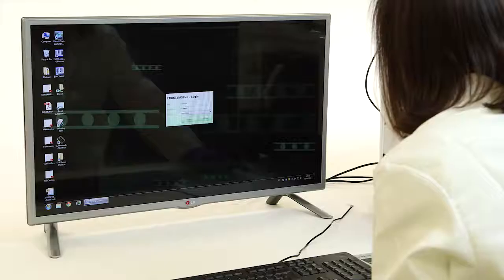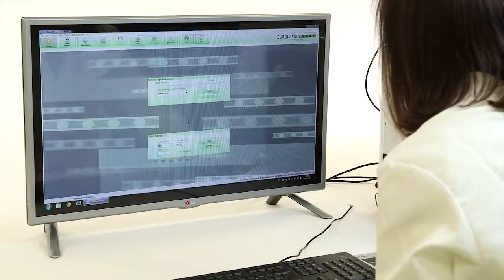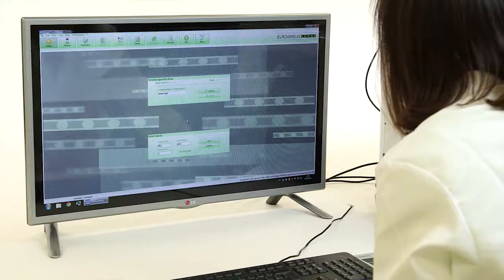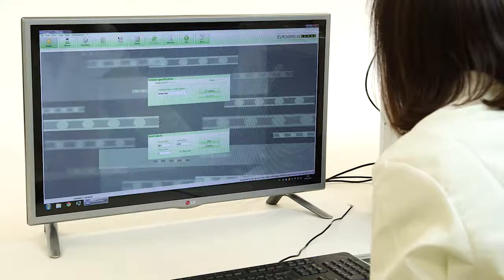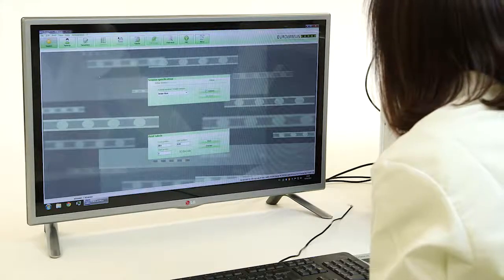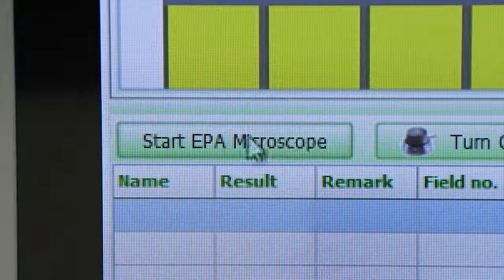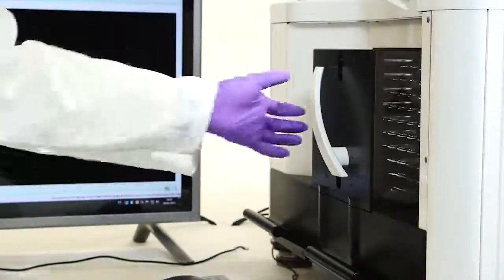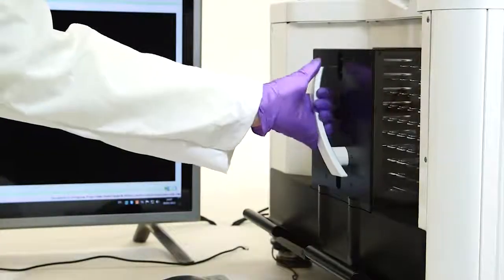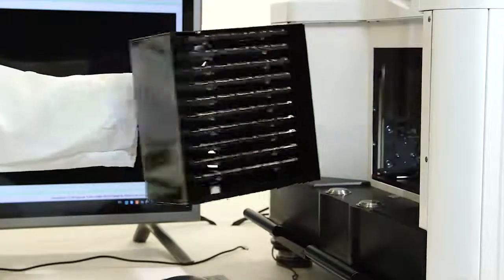At the PC, start EuroLab Office and select Activate to start the required session. Then click the Start EPA Microscope button. Next, simply load the magazine with slides bottom to top.